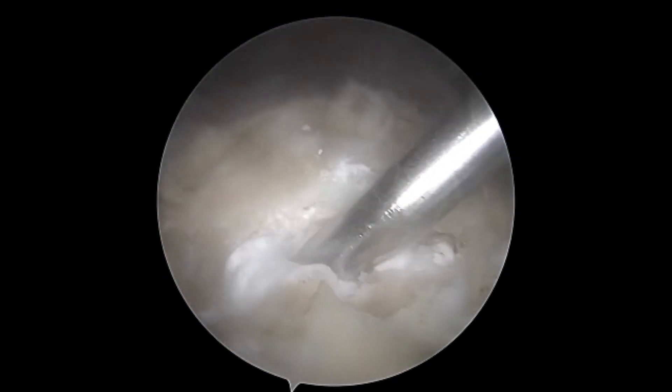Tactoset is a calcium phosphate synthetic bone graft, which is highly flowable and easily placed percutaneously.